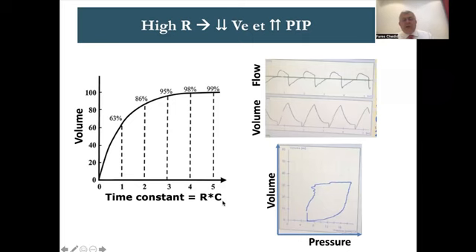So if you are rounding on your patient and see that the inspiratory time is enough, and 10 minutes later you see a graph like this one with a short I time, no way that the compliance has changed so much and improved so much over 10 minutes or 5 minutes. So by definition, a short I time that was normal before is increased resistance, until proven otherwise.